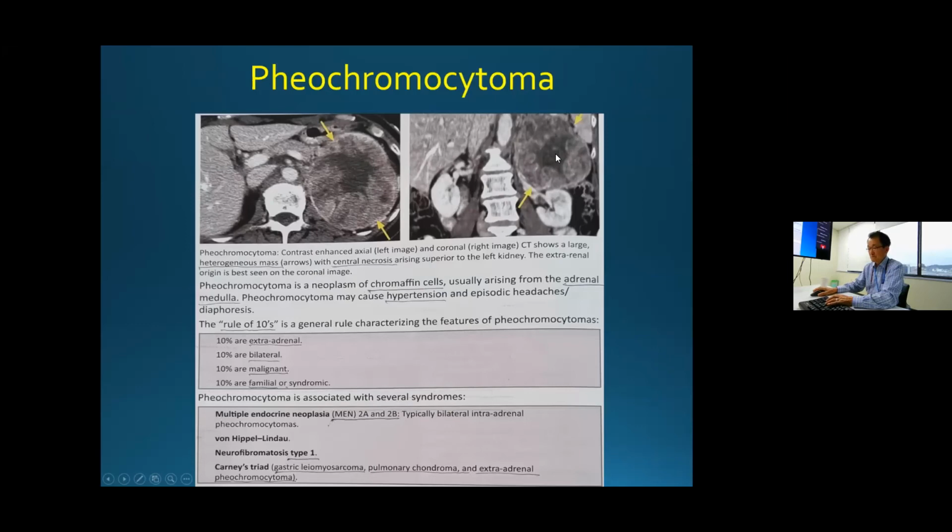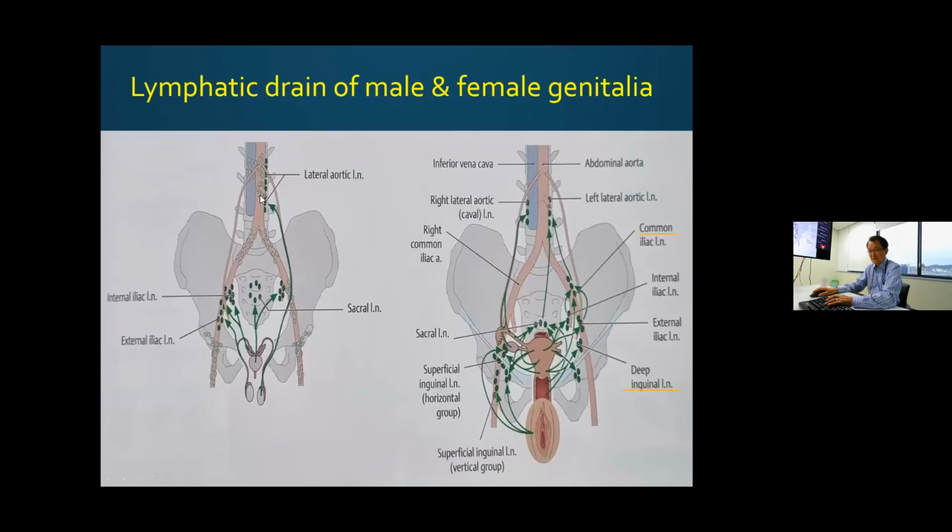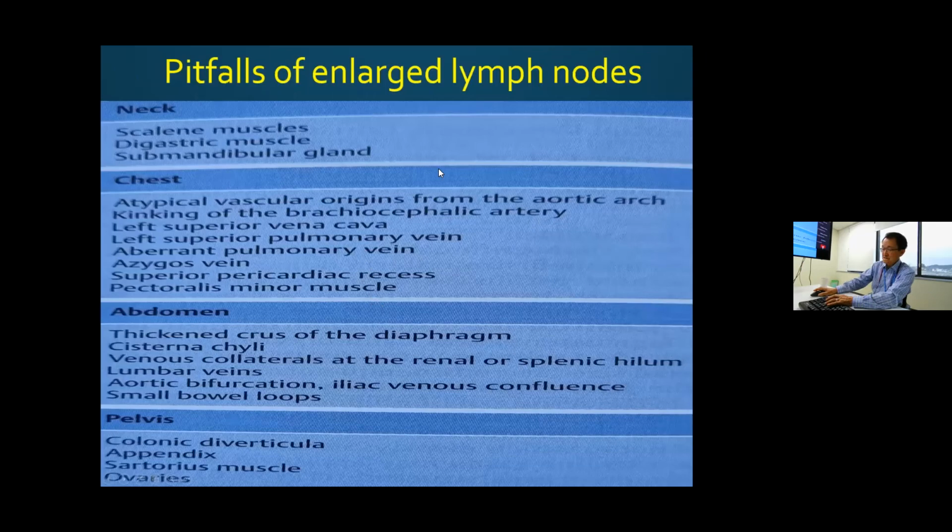And the abdominal lymph nodes, I mentioned retroperitoneal. And the pelvic lymph nodes: external, internal, common areas. Depending on the location, you have to describe them, as I said, depending on the relationship with the aorta, inferior vena cava, and the level. In the external area you have medial, lateral and obturator nodes. The internal and common areas also have medial and lateral, just a little extra. On CT and MR, anything greater than 1 centimeter makes you suspect lymphatic metastasis in a cancer patient, but less than one, you cannot tell what it is.